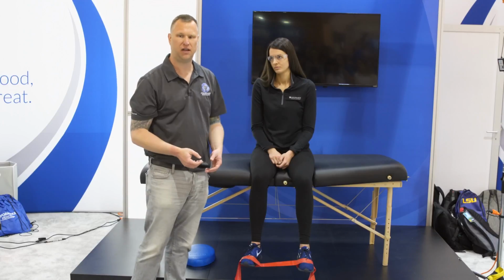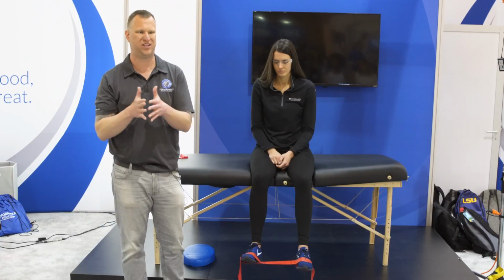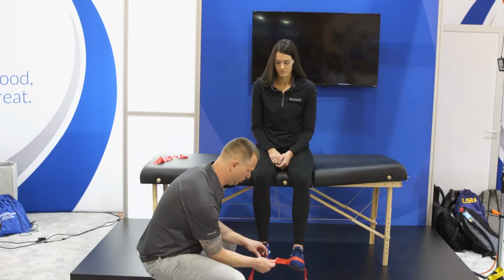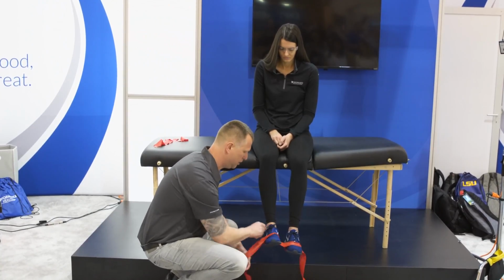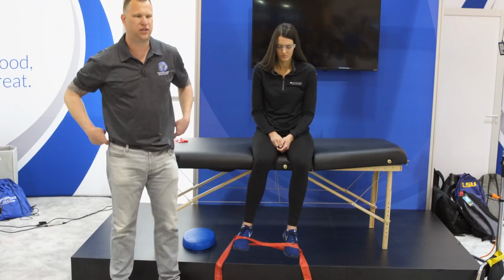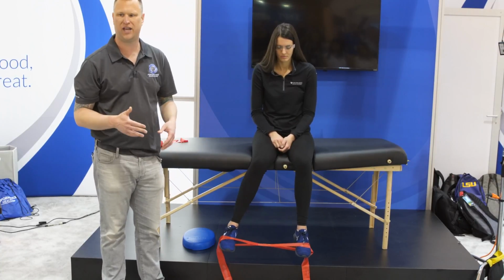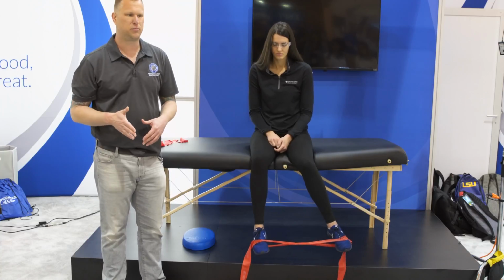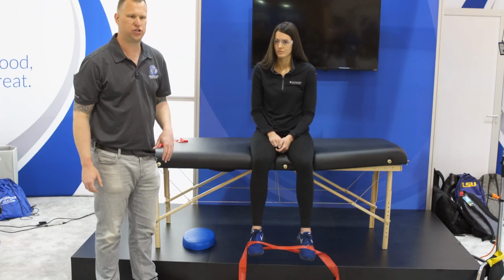What if we needed to progress it and make it more challenging? Well, there's the ease of the CLX, because when I set this up, I skipped a loop effectively. So we can quickly change resistance levels by how we position those loops. So I simply, for week 1, have a gap, and maybe by week 2, I've adjusted that up. I've shortened the distance between the loops. We're doing the same exercise, but we've effectively progressed her from week 1 to week 2, whether she's doing concentric, eccentric motions, or again, the reactive isometrics, okay? So this starts adding to the foundation of deep hip internal, external rotation musculature, okay?